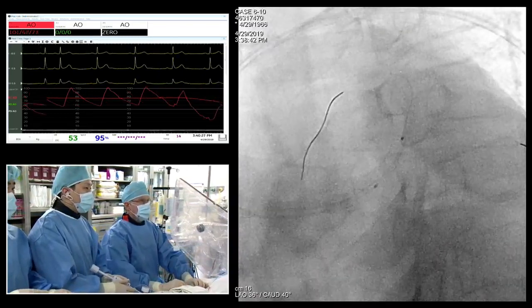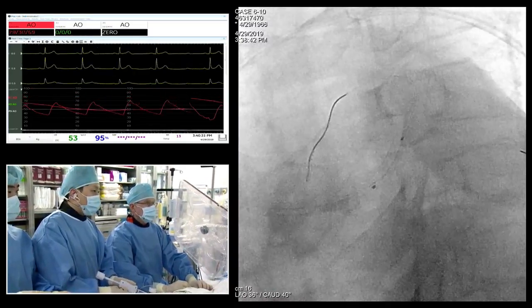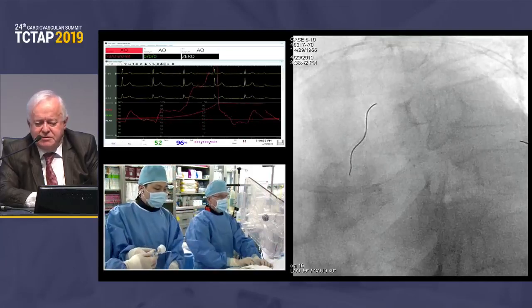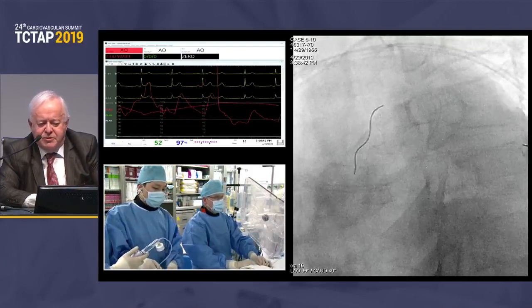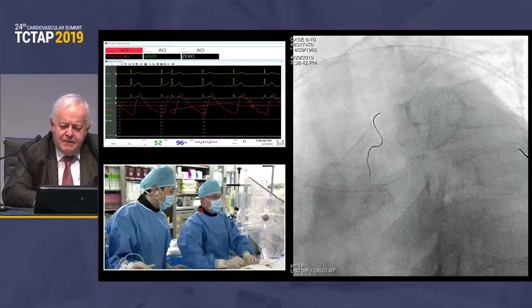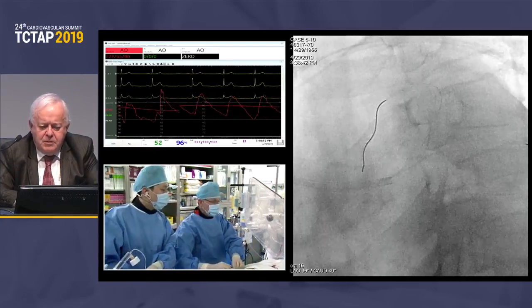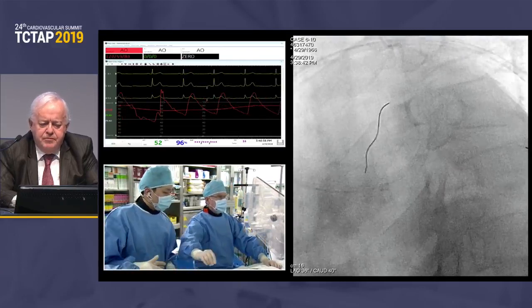If I can make a comment about this inflation, it has been demonstrated that a stent cannot be deployed in 5 seconds. So I think it's an important point to remember that you are not reaching the diameter in 5 seconds. So 20 seconds. Even you can repeat the second time or third time, if hemodynamics are a concern. Sometimes people, because it's the left main, go up and down, bang, bang, but I don't think so. You can relax and take your time.